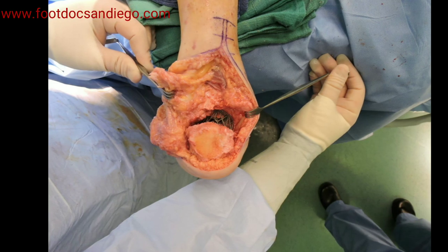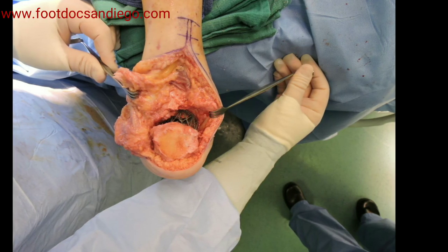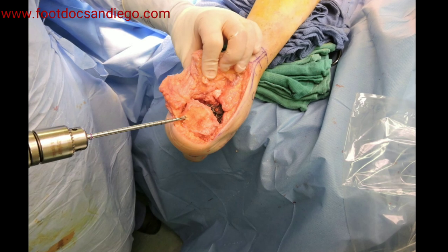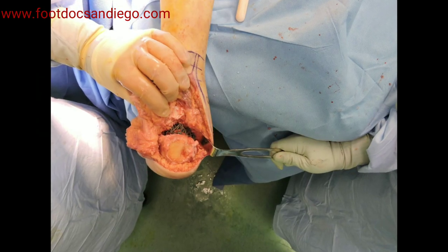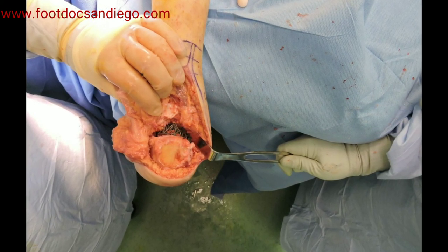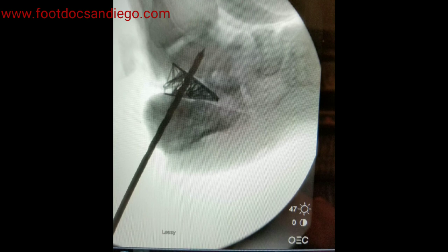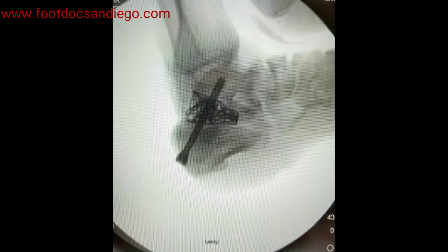Here it is prior to closure, and here are the grafts in place. Also here is the placement of the screw that will help prevent shifting — it is very stable in a well-fixed position. You can see we double-check everything using the fluoroscopy machine, and this is to make sure that the screw is not going too far out. You do not want it exiting from the front of the ankle. Here are your final pictures with the screw holding everything in the right place.